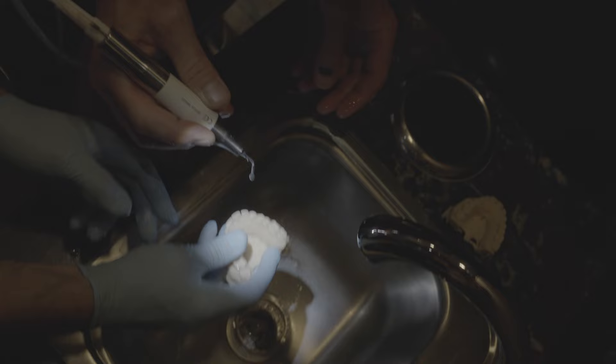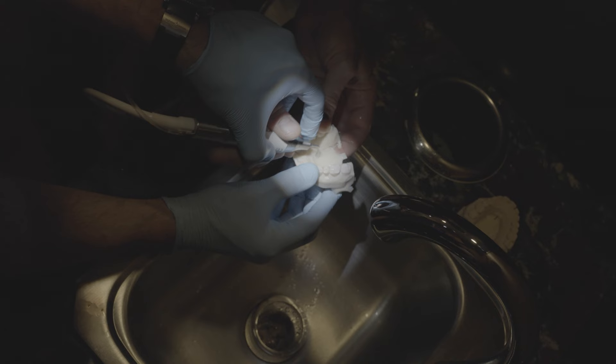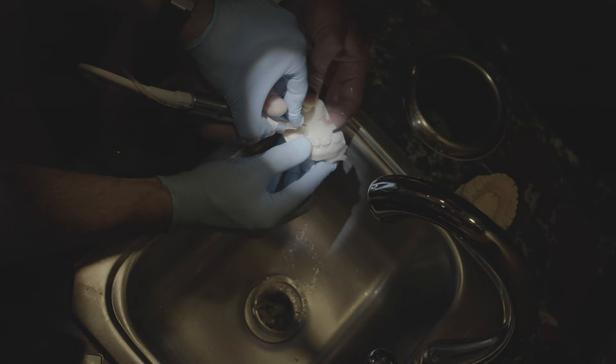This is pretty simple, it's the same thing. Don't press in one spot because it'll burn. You've got to keep going kind of back and forth until this goes in all the way.